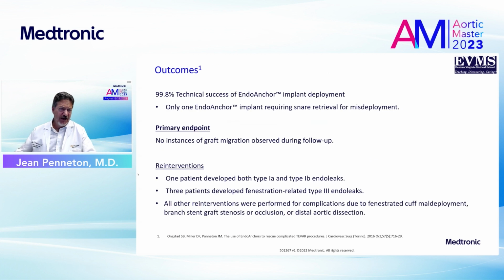The outcomes of those patients: we had a 99.8% technical success of EndoAnchor implant deployment. At the intended deployment, we had no instances of graft migration in very challenging anatomy.